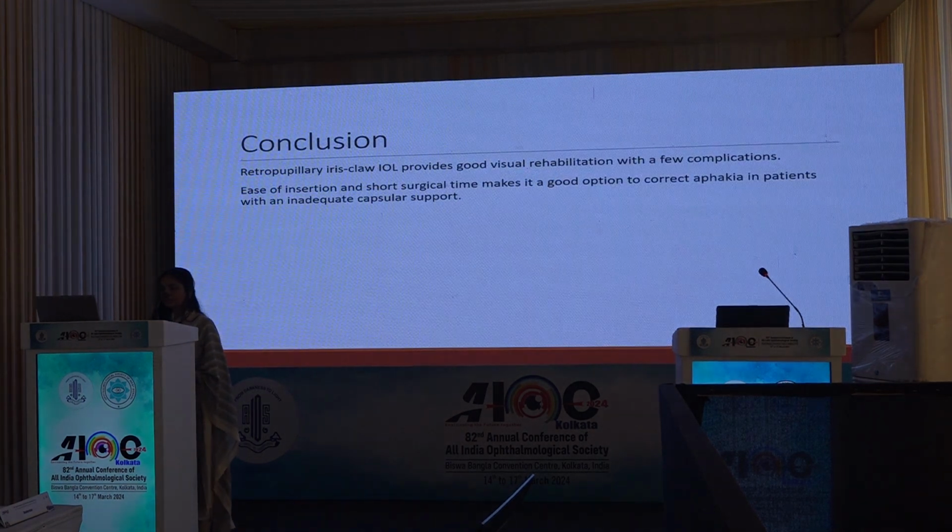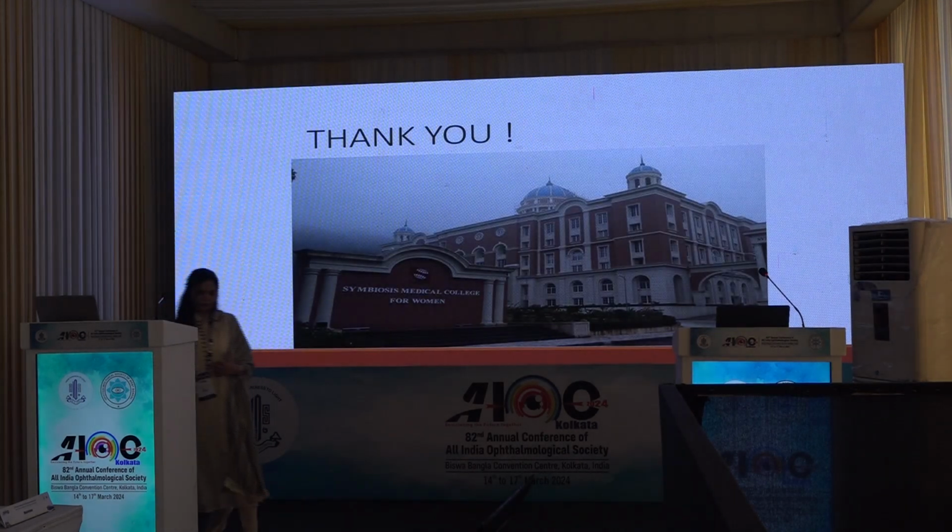Finally, the conclusion. I would like to conclude that the retropupillary iris claw IOL provides good visual rehabilitation with fewer complications. Ease of insertion and short surgical time make it a good option to correct aphakia in patients with inadequate capsular support. And thank you.